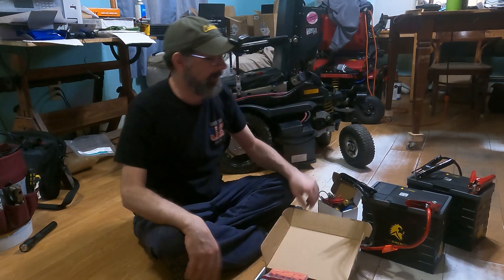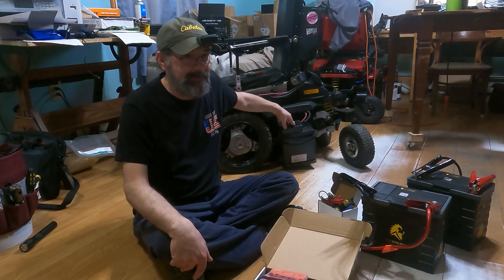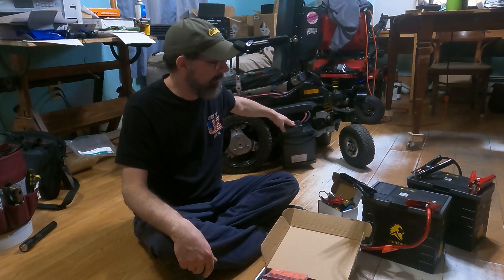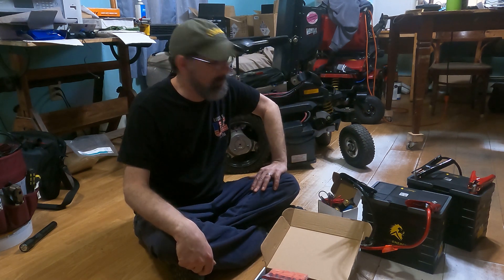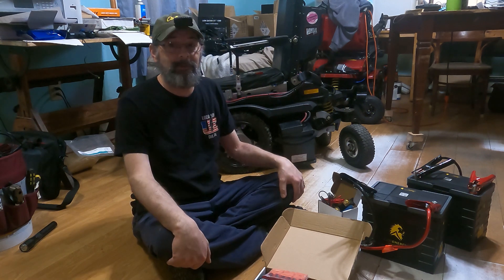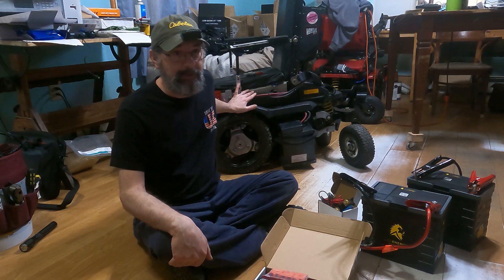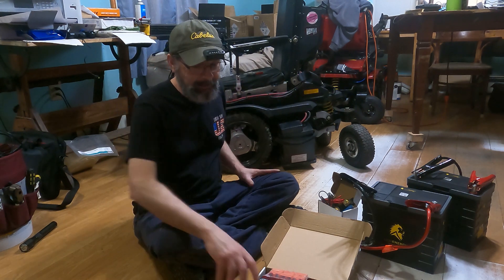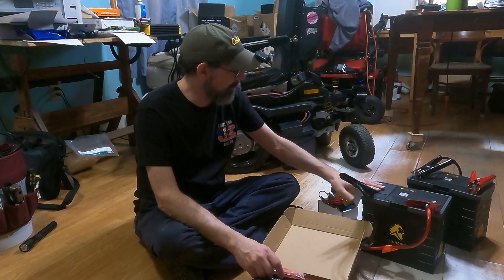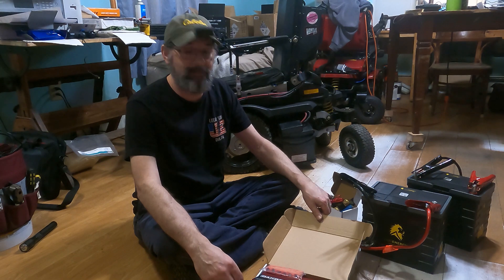These batteries are also much lighter — about 23 pounds versus lead acid at around 55 pounds each. So that's where we are today. I'm going to get to work eliminating some of the things we've previously done to this chair, then set it up with the new charger, new plugs, and new batteries, and install the shunt so we can keep track of what's going on.